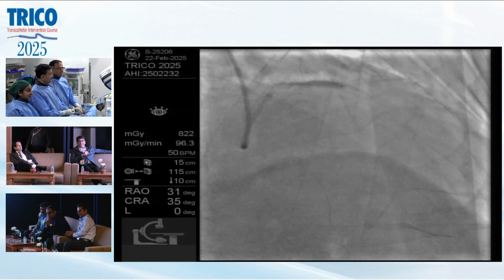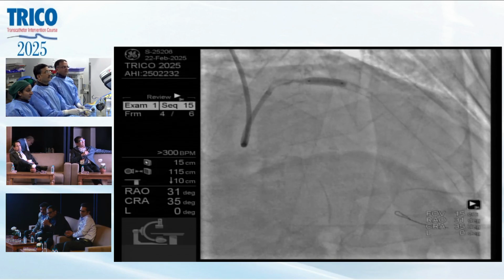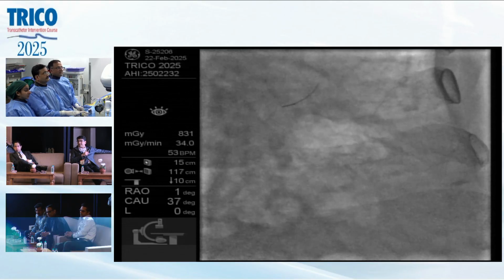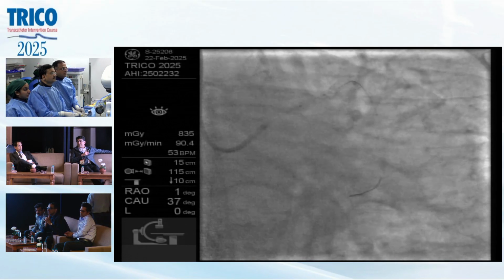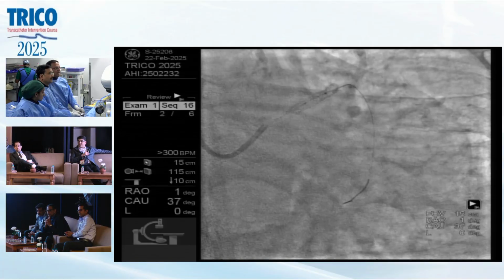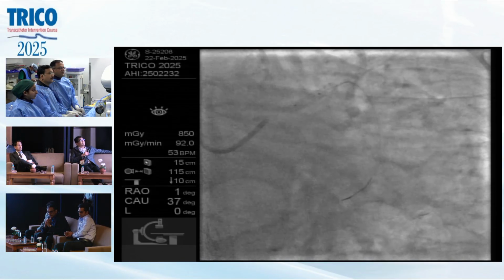Samir, homogeneous, heterogeneous, and layered, these are the three varieties, and they say, even they have done the study, that only in the homogeneous type does the drug-eluting balloon work. Whatever others are malignant. But the new classification, published in 2021, again by Japanese colleagues, is type 1 to type 6. Type 1, type 2, maximum type 3, it works. Types 4, 5, 6 are again malignant. We will discuss, if we have time, during our panel discussion.